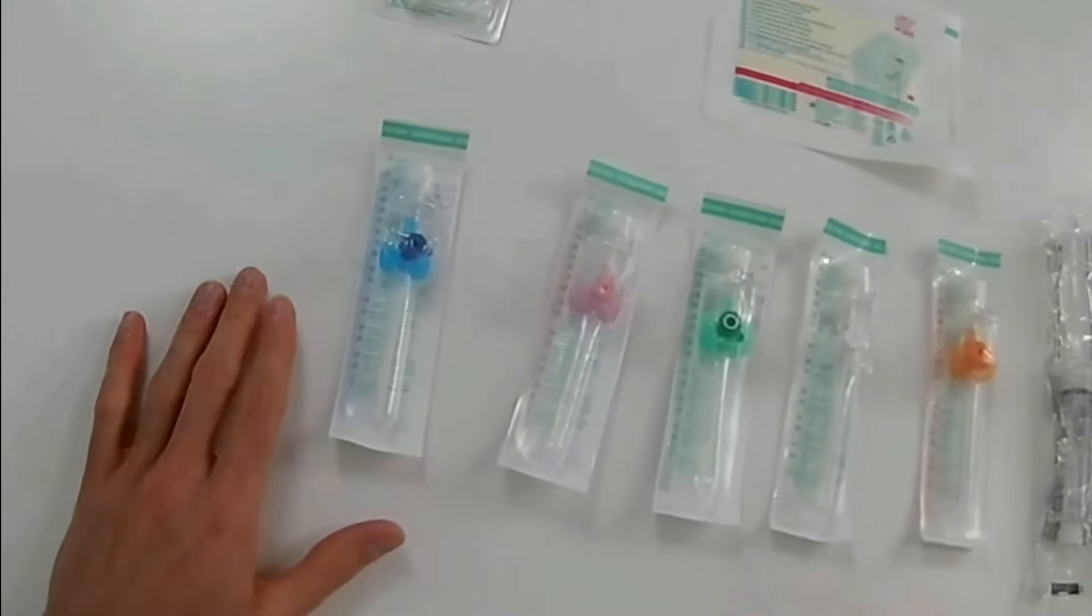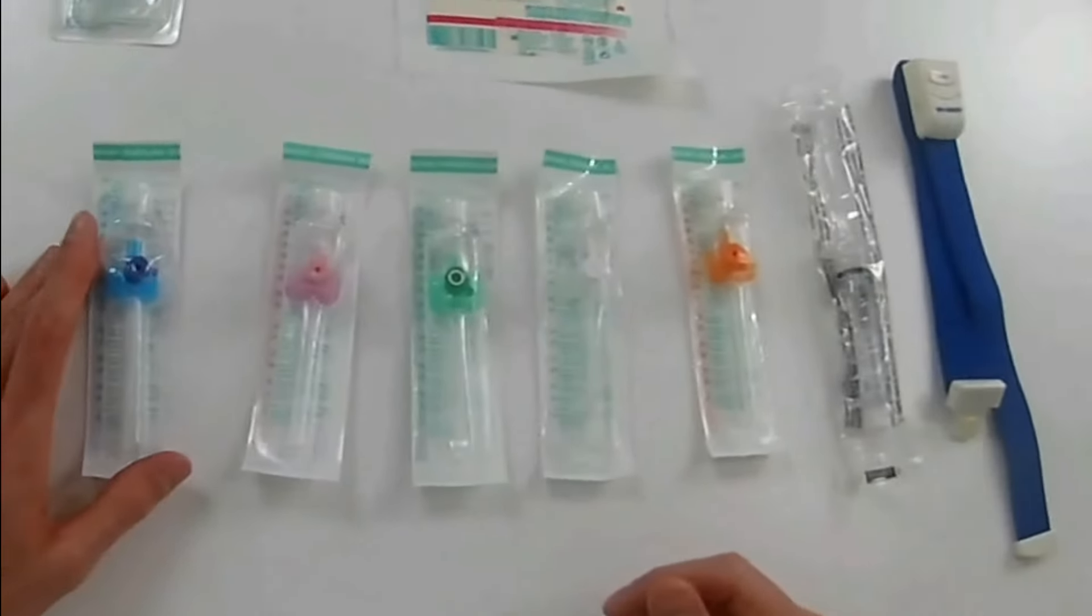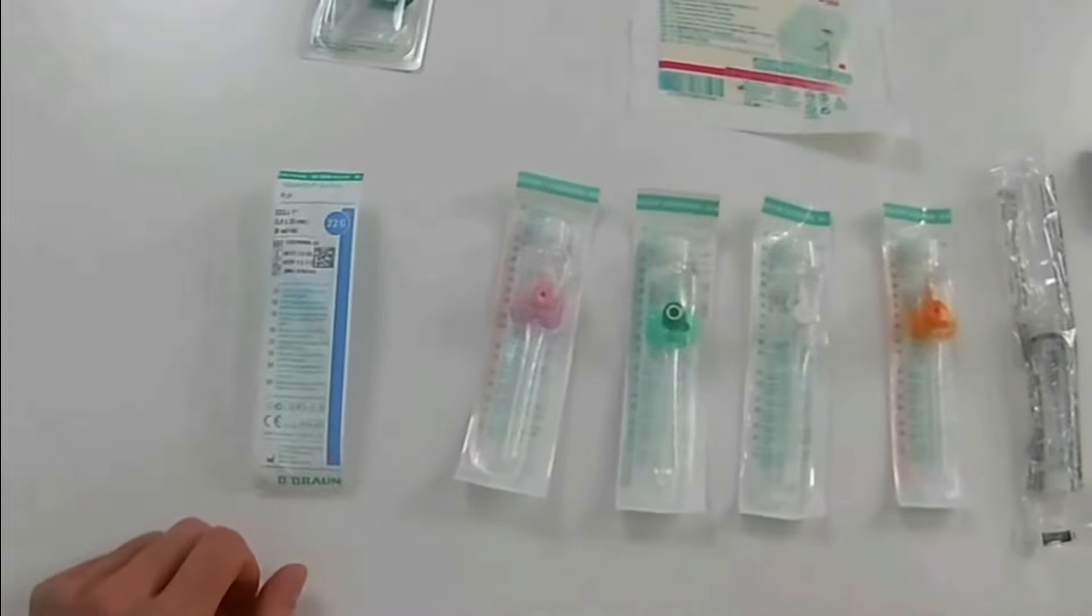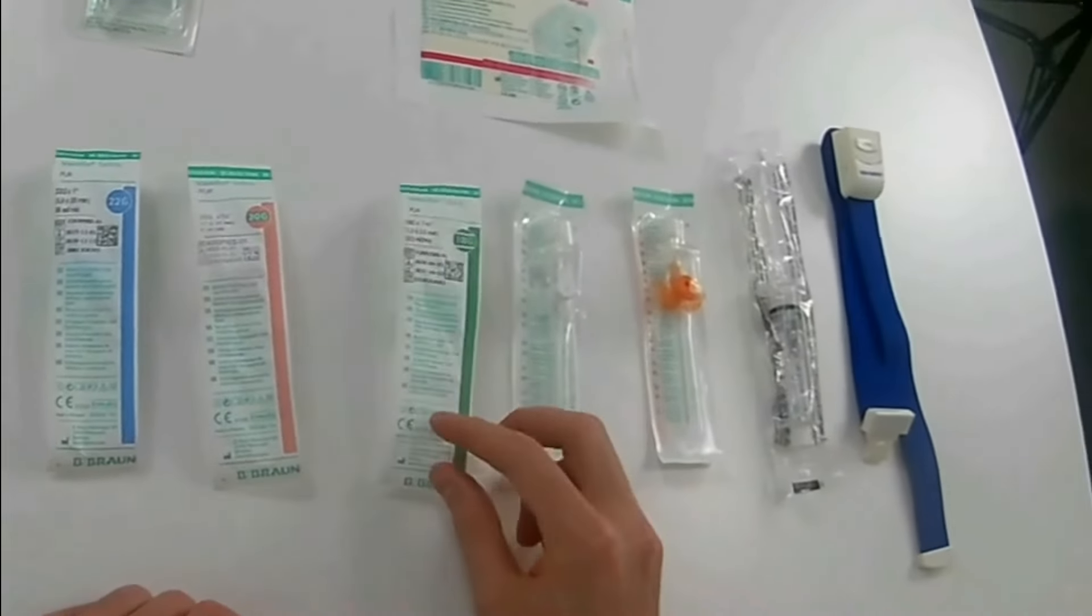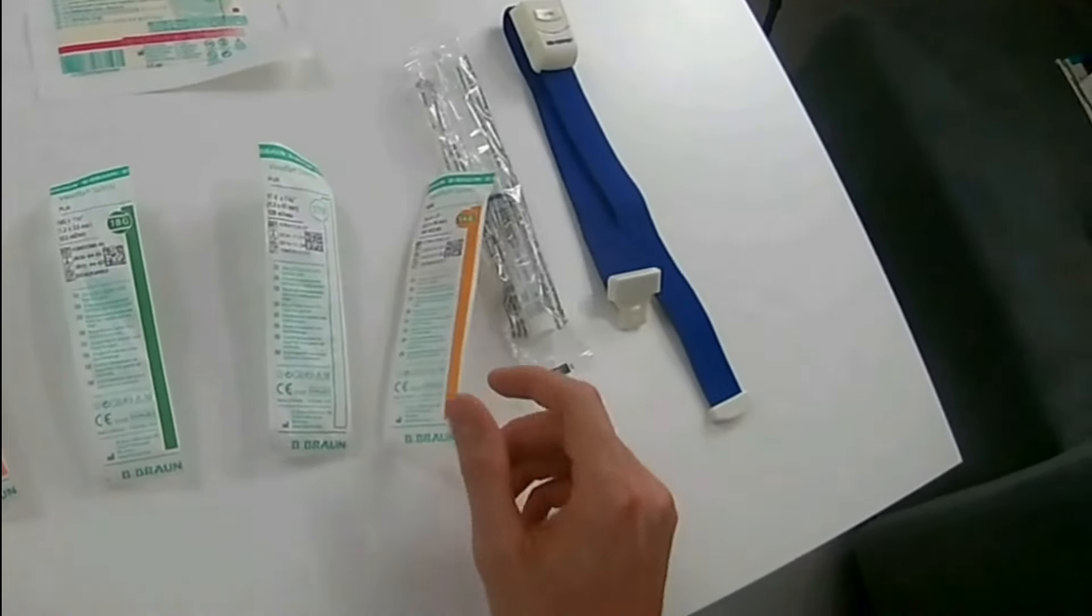The ones we have normally for adult patients and children in general is starting from the blue and becoming bigger. So you have the 22G, which is the blue one, then the pink one 20G, green 18G, white is 17G, and the orange is 14G.